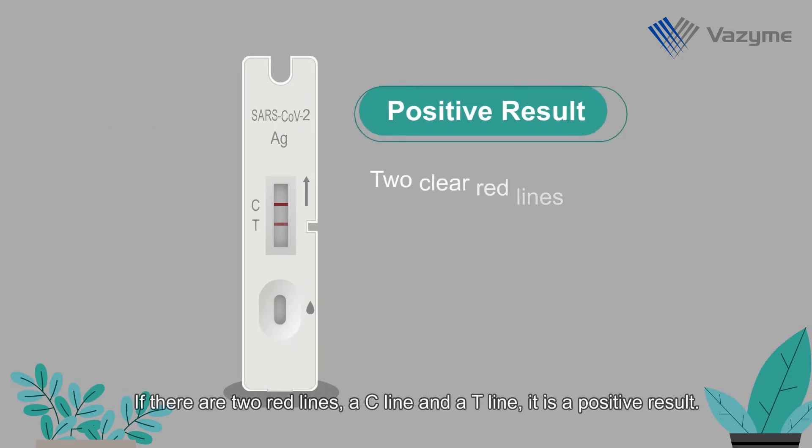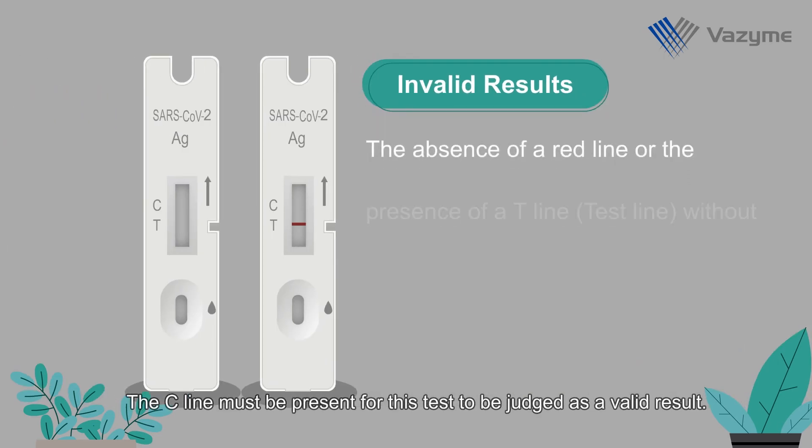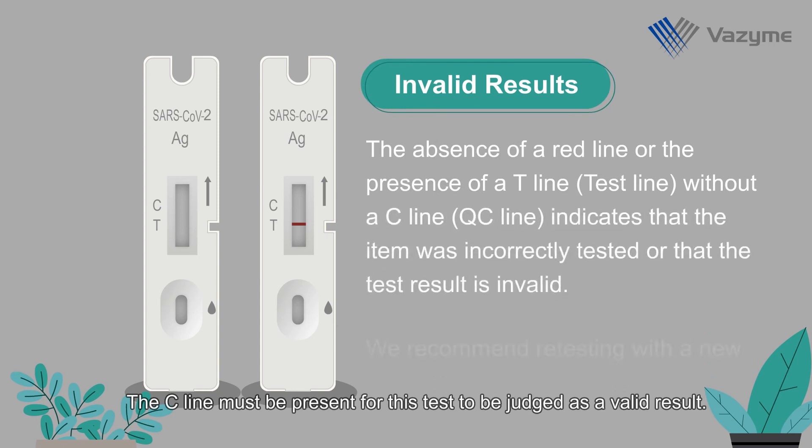If there are two red lines, a C line and a T line, it is a positive result. The C line must be present for this test to be judged as a valid result.